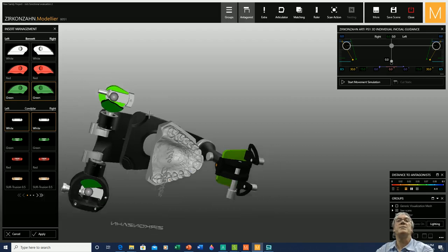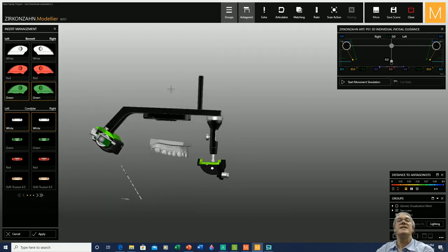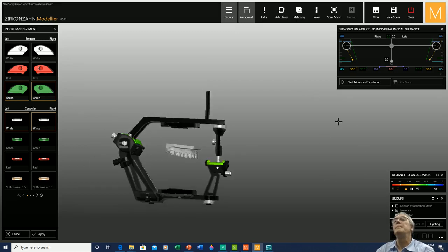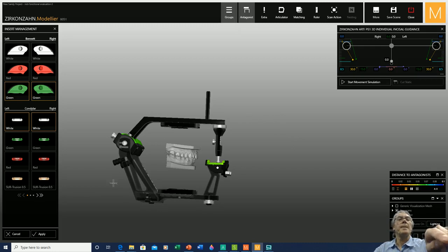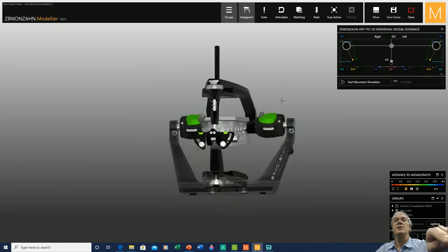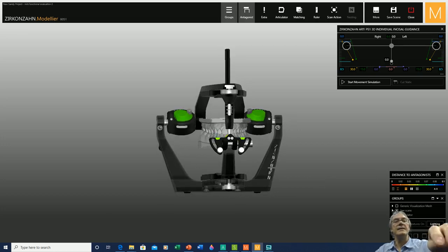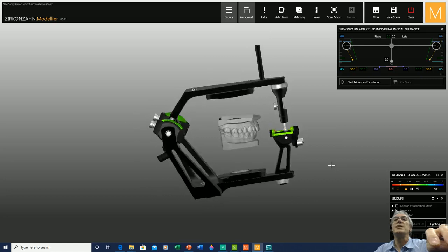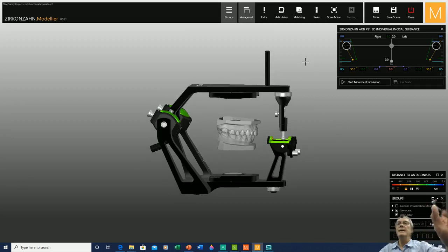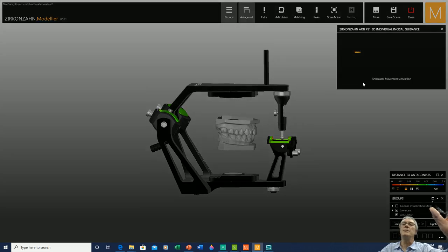The articulator is now set with the standard values we are looking for. We can bring the articulator back to its original shape, apply and accept what we have performed. We are now ready to move forward to the next step, which is the functional analysis of the articulator itself. We are not going to use the individual anterior guide plane today, so we'll keep it at zero, and once all values are set to standard, we'll perform the movement simulation.